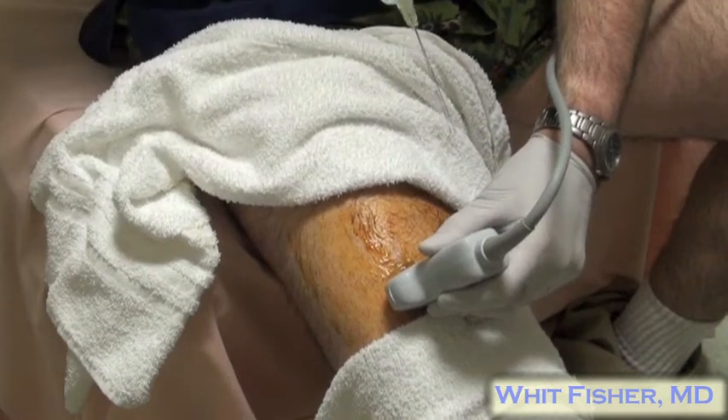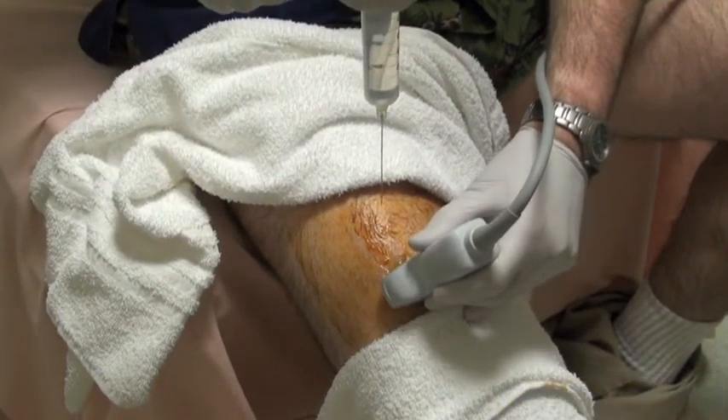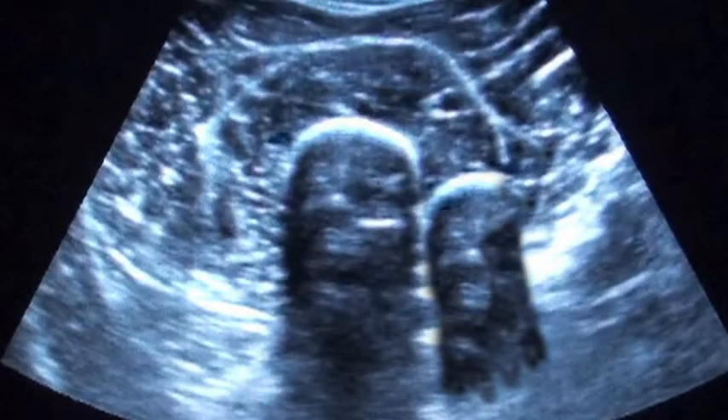I know I'm not using sterile technique here — I'm doing this right before my shift in my underwear with what I've got. Once you can image the fracture site, you're basically aiming to place your needle right about there. You draw back on your needle and then inject.